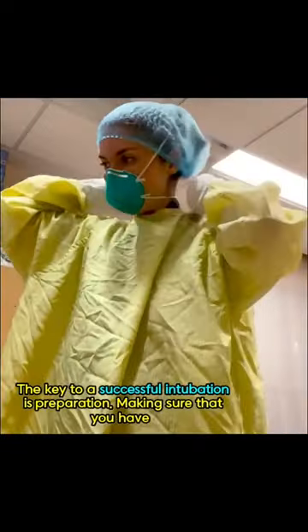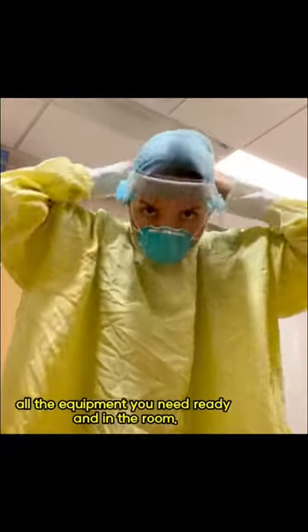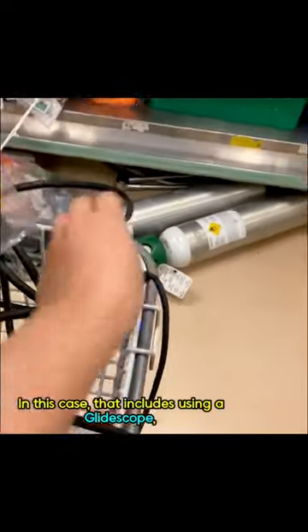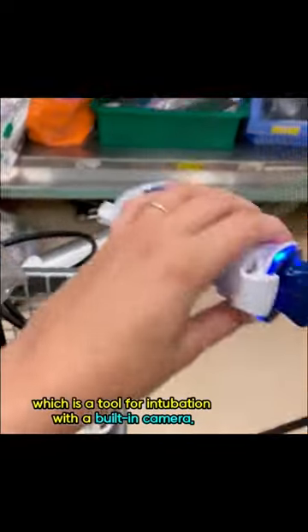The key to a successful intubation is preparation — making sure that you have all the equipment you need ready and in the room. In this case, that includes using a GlideScope, which is a tool for intubation with a built-in camera.